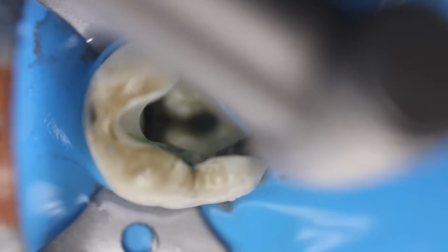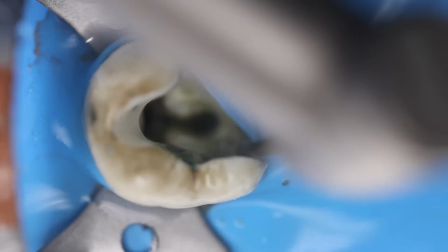Again we are moving against the wall, and you can see that a lot of black debris is coming out. These are the infected dentine that has made the tooth structure weak. We are again refining our access cavity. See, we can easily move this bur on the pulpal floor. It will not perforate the pulpal floor. So it is the safest bur that you can use during access preparation.